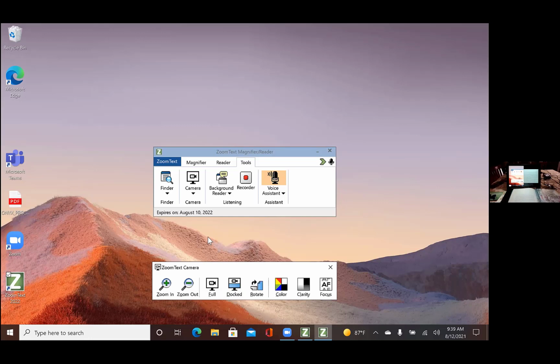Thank you. Yeah, thank you, Richard. I forgot that part about it. Because once it's done, you don't have to worry about doing that again. It wants to make sure it doesn't override, perhaps if you have another camera, the first time you do it. So it's asking you, do you want to launch the camera the first time you do it? And from there, it will become the default and it will automatically launch it every time. You can override that again if you wish, but then it's assuming that this is your camera of choice, and so we'll automatically launch it.